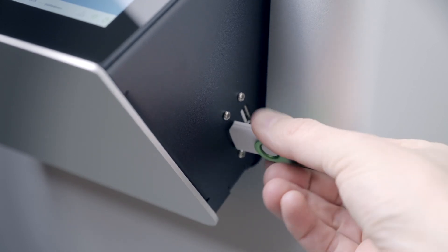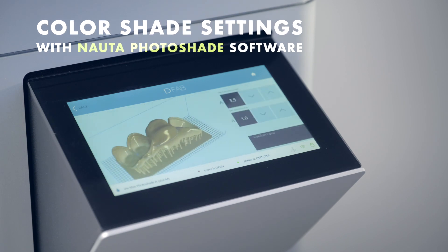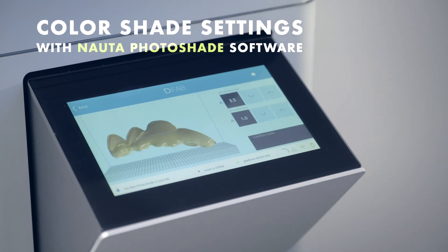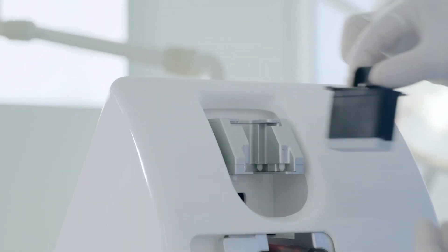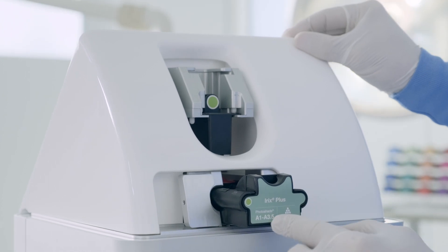Using Nauta Photoshade proprietary software, the operator can quickly and easily set the position and amplitude of the desired color shade on the 3D restoration model. All that remains now is to insert the printing platform and the disposable cartridge.